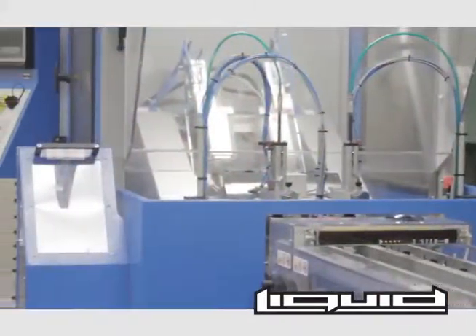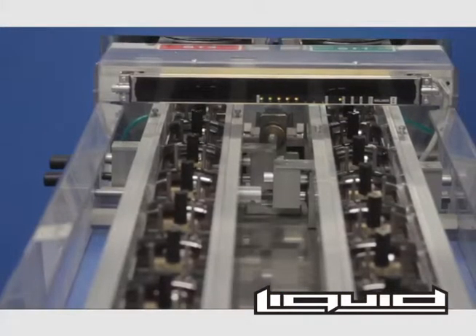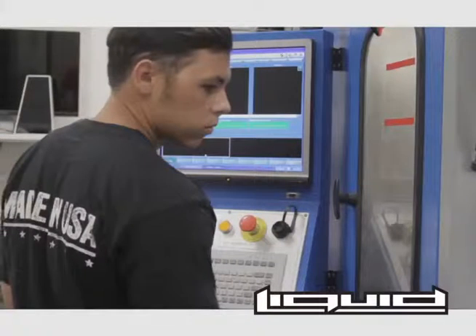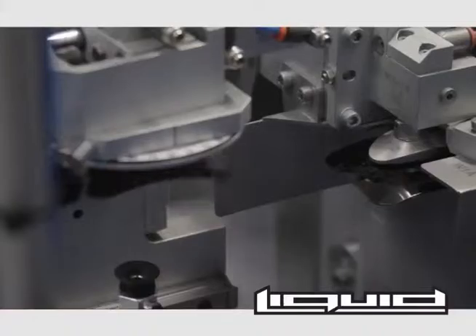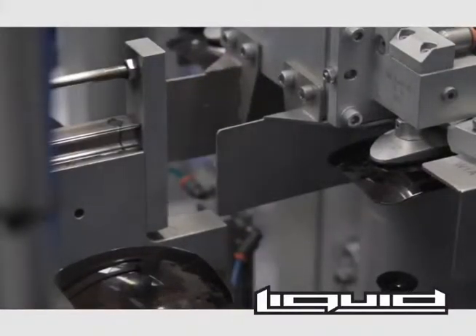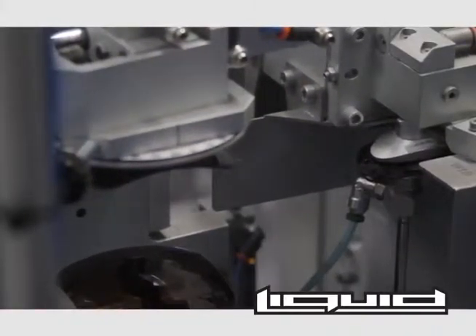Liquid Eyewear uses state-of-the-art technology when it comes to cutting their world-famous lenses. This robotic system is the most advanced machinery on the market, designed for high-performance lens edging. This technology allows for edging of both left and right lenses simultaneously, which reduces production time and increases output. When finished, it even stacks the lenses for you.